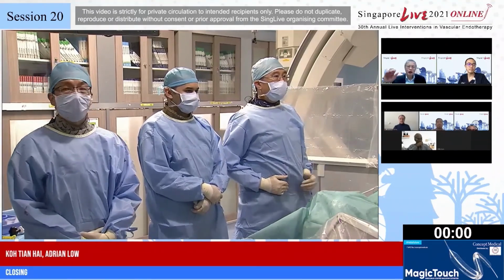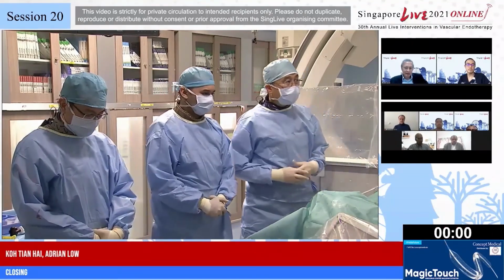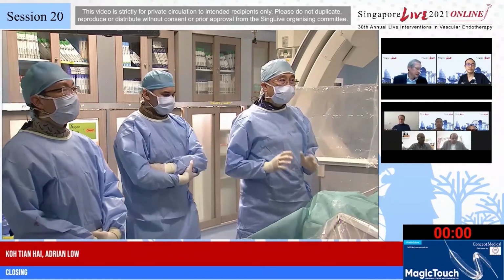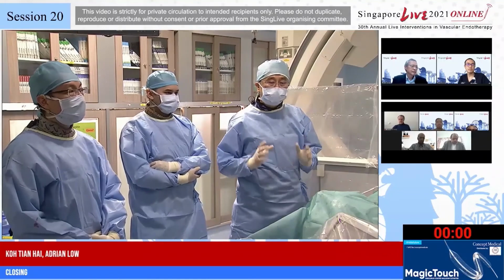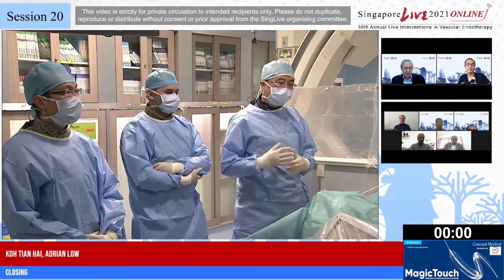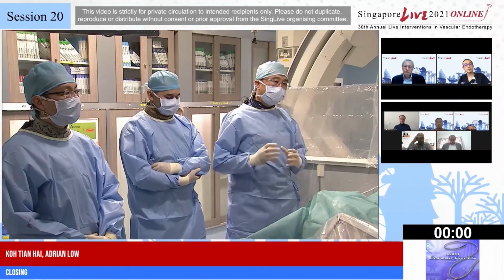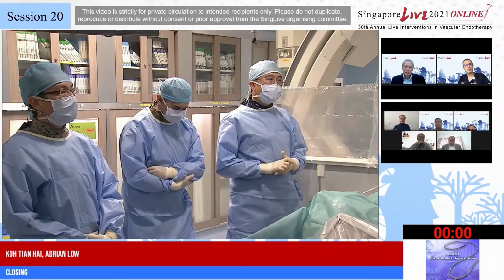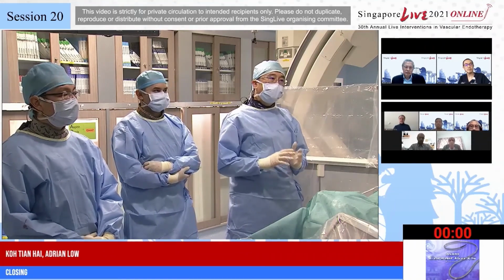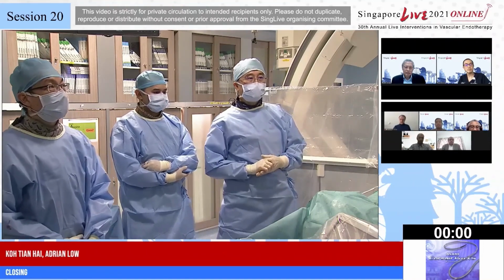Okay, thank you very much. Today we demonstrated that the acute implantation of the bioadapter is very much similar to the metallic DES, and no special precaution is needed, unlike the BRS with the pure polymer platform. The technique is exactly the same. It is very deliverable, it is quite conformable, and knowing the expansion limit will also allow us to treat it more like the metallic DES.